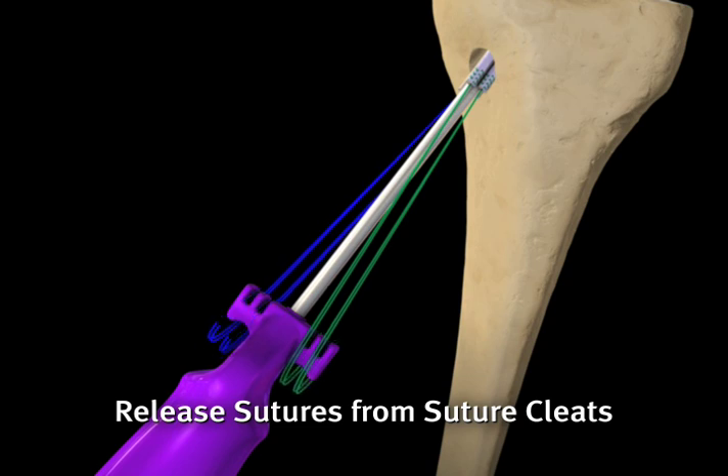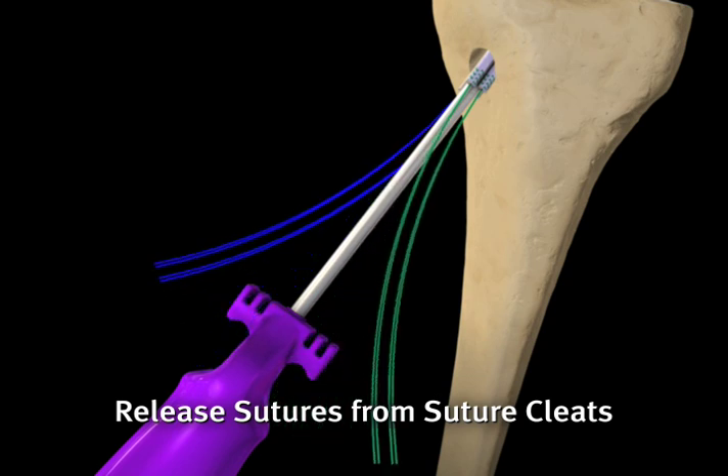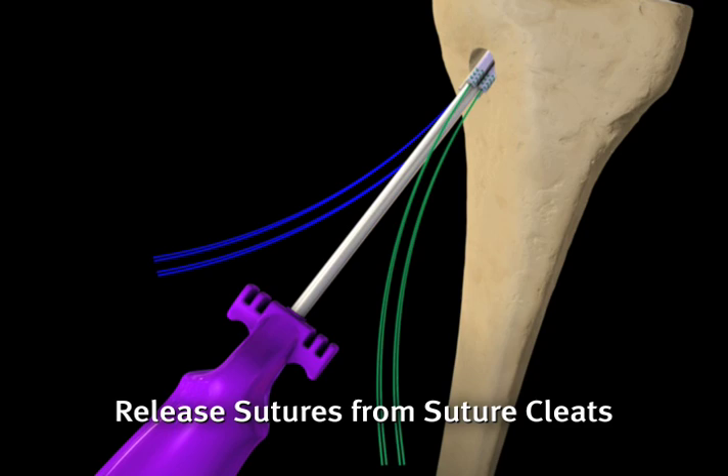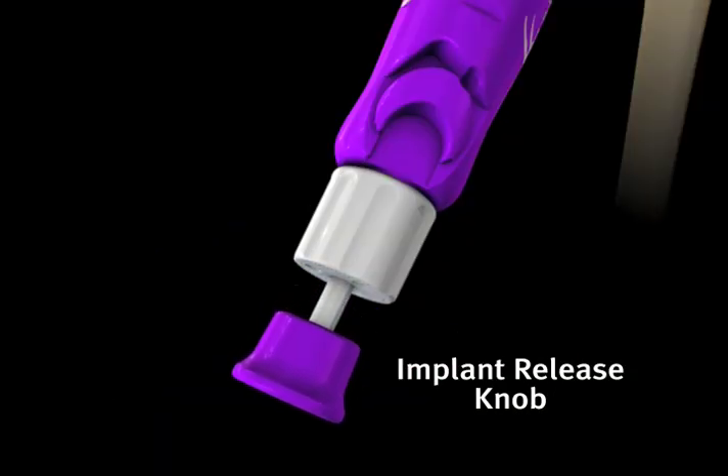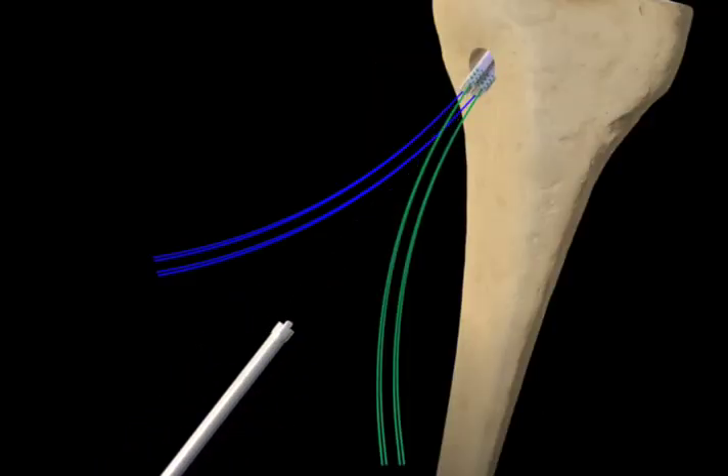Once the implant is fully deployed, the whip-stitched sutures are now disengaged from the suture cleats. The inserter handle is then released from the implant by pulling the implant release knob and then drawing the inserter handle out of the tunnels.